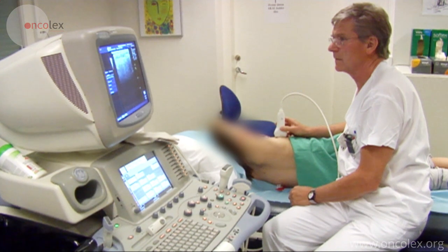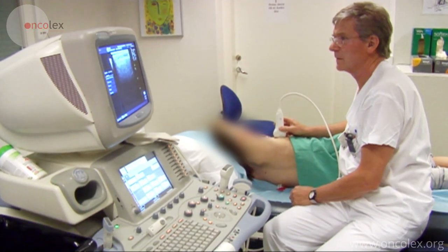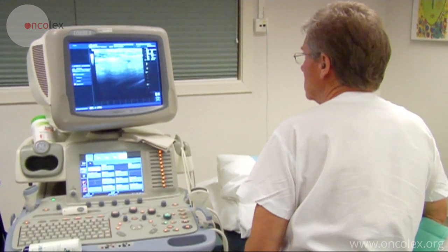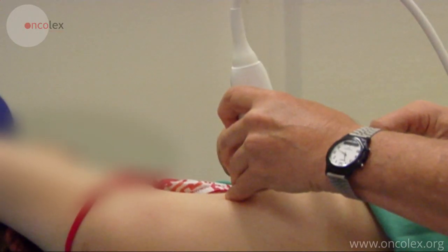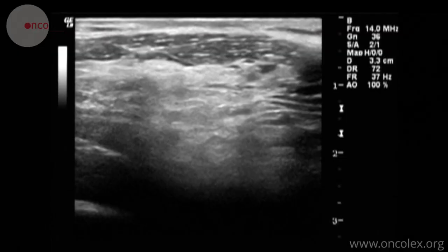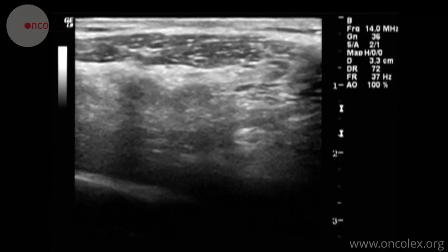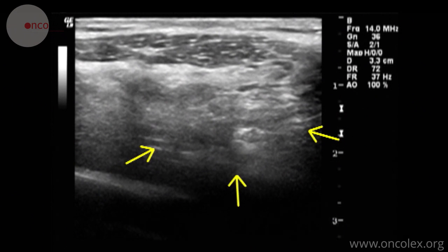This is a video of an ultrasound-guided histological biopsy from a soft tissue sarcoma on the right side of the thorax. The tumor is first examined using ultrasound. Here we see the contour of the tumor.